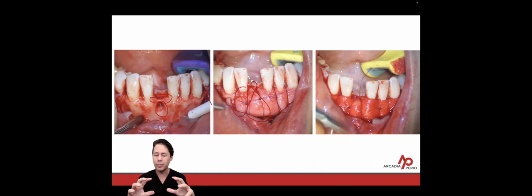Now, while I'm in, I also want to address that soft tissue component. So in the figure on the far right, you can see here I've used microderm layered over the resorbable membrane and sutured again with subperiosteal mattress sutures. So this is more of a sandwich type technique or a layered technique. This works really well in my hands. I want to address everything simultaneously. So when I come back to place the implant, my life is going to be a lot more straightforward.